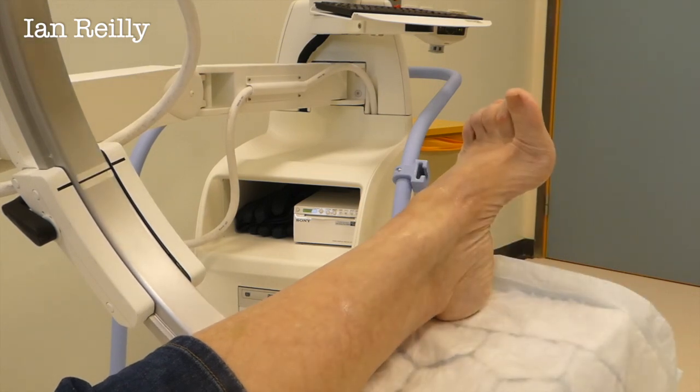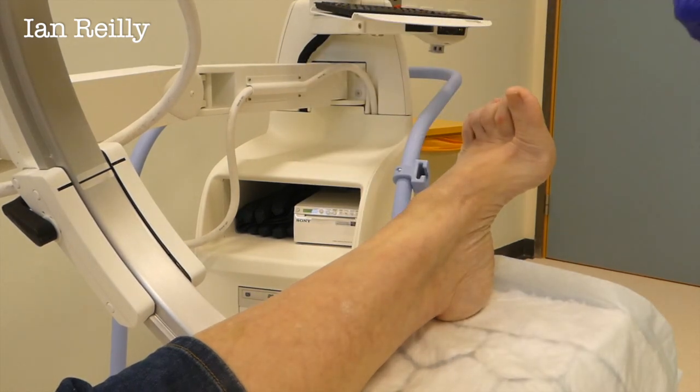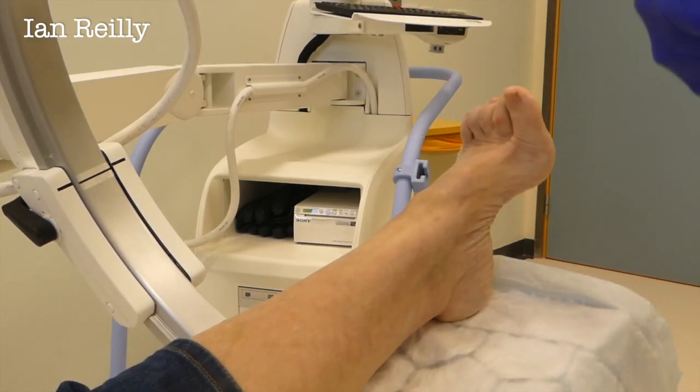Just check for any bleeding, and then we'll put a little plaster on and we're done. Rule of thumb, Pat — take it easy the rest of the day. It can be a bit stingy today. You'll be numb for the next hour or two. But then over the next two days to two weeks, the effects of the steroid will kick in.